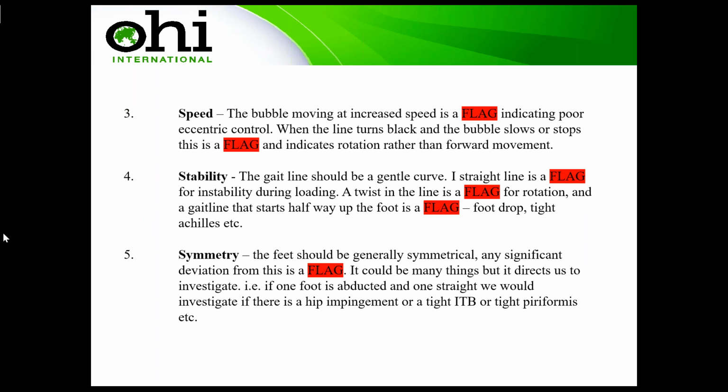Now what we're seeing is we've got an internal rotation on the right side, or ASIS is going to be pushed anterior on the right side and posterior on the left side. So we are going to get a rotation happening through SIJ. So that's sort of fine tuning the need to really go and have a look at this patient's sacroiliac joint and to determine whether or not this person has a leg length difference, and if so, is it functional, is it reducible?